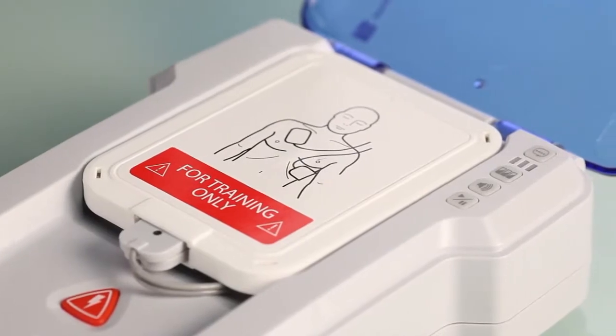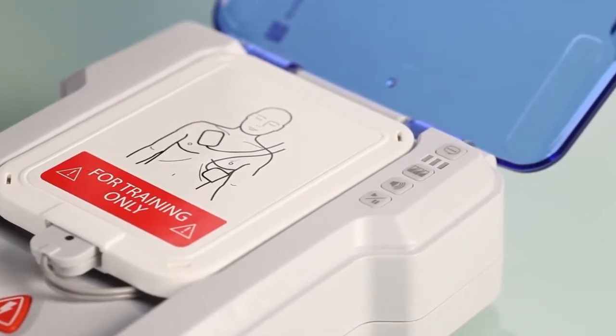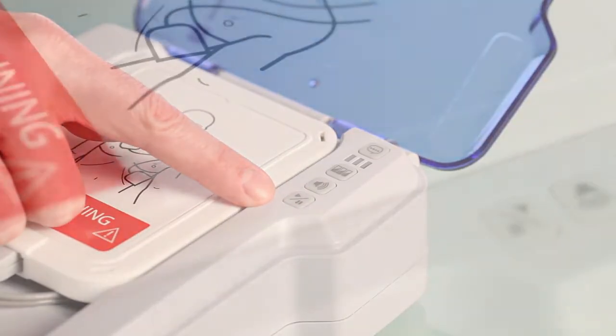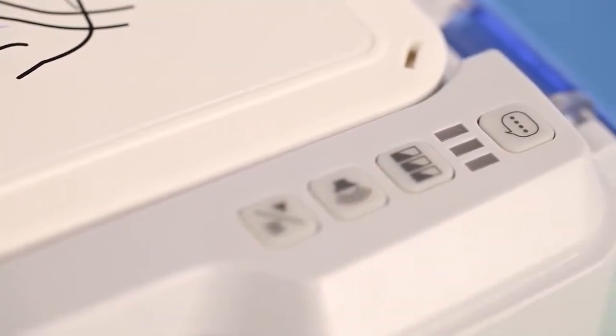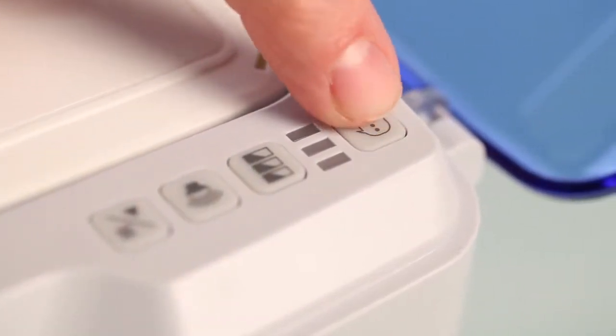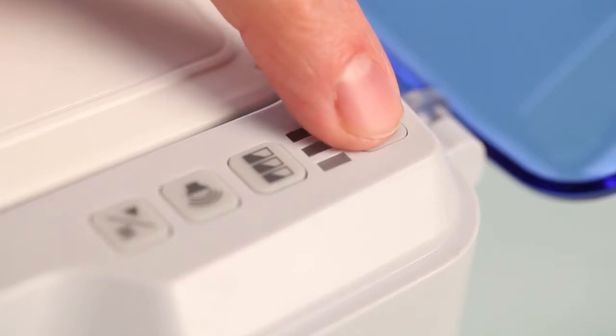On the right side of the AED trainer is the control panel with four buttons and three indicator lights. The language button allows you to select the language for the unit. Simply press the button to toggle between the two languages: English and Spanish.